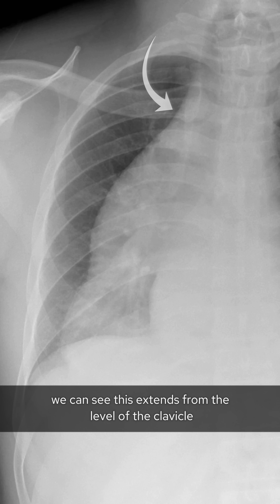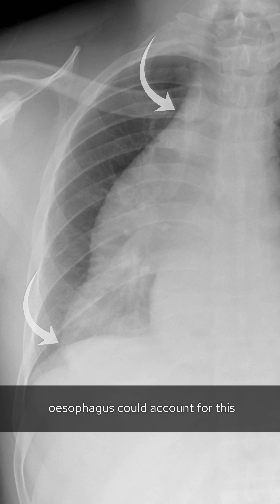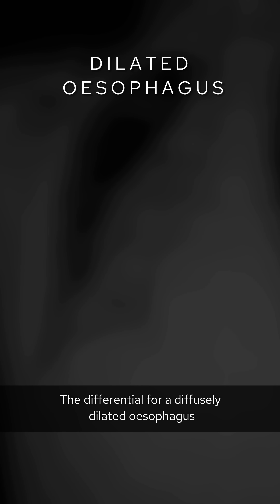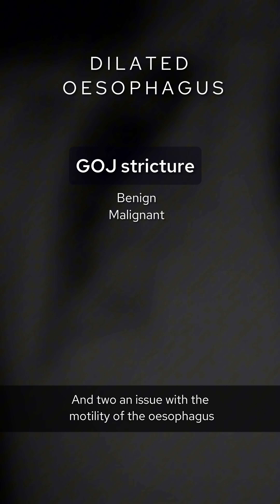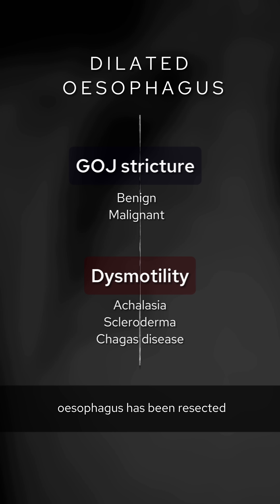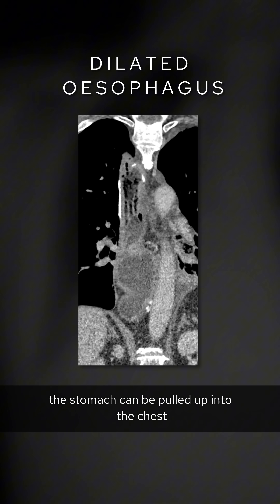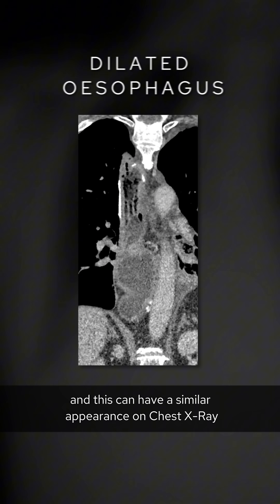With our lesion, we can see this extends from the level of the clavicle all the way down to the diaphragm, so a completely dilated esophagus could account for this. The differential for a diffusely dilated esophagus can be split into two: one, a stricture at the gastroesophageal junction, either benign or malignant; and two, an issue with the motility of the esophagus, where we consider achalasia, scleroderma, and Chagas disease. If the esophagus has been resected, the stomach can be pulled up into the chest — called a gastric pull-up — and this can have a similar appearance on chest x-ray.